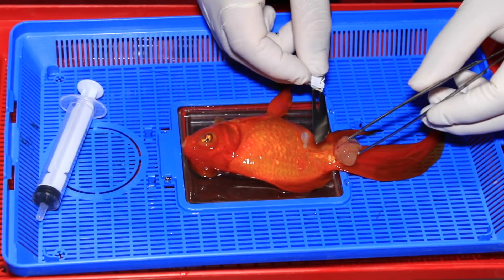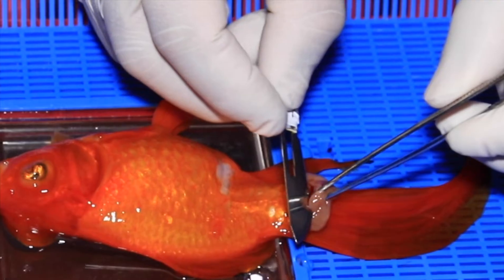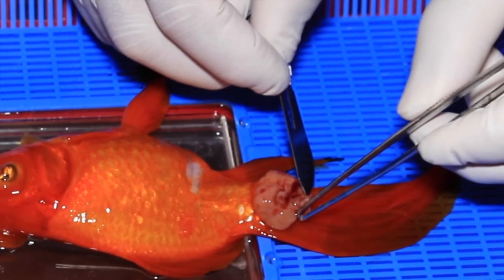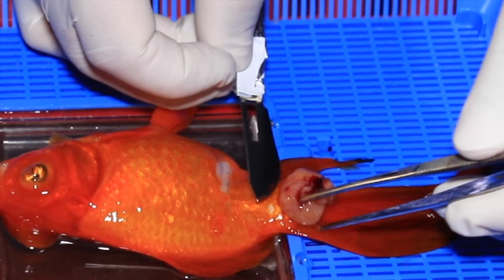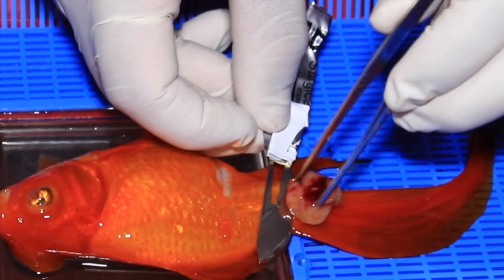We'll be irrigating intermittently with the anaesthetic solution, and if she's going too deep we'll irrigate with fresh water. I'm taking a tiny bit of the surface of the tumour off first just to see how much it's going to bleed and to get a feel of the texture. It's very friable, indicating it can break very easily — a tumour like this is going to likely cause pain every time it's knocked because it just breaks apart.